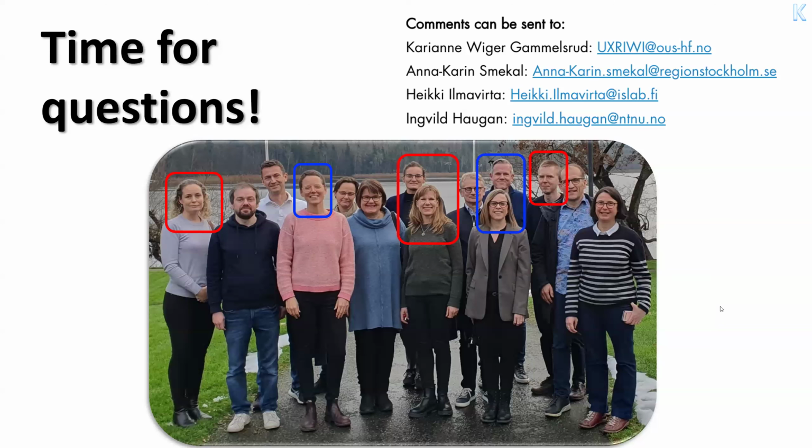Erika, did you want to comment on that? Not exactly on that, but since you mentioned testing with different methods, I just wanted to comment that as far as I know, the piperacillin-tazobactam gradient tests have never been validated for enterococci. So I think that's important to know.